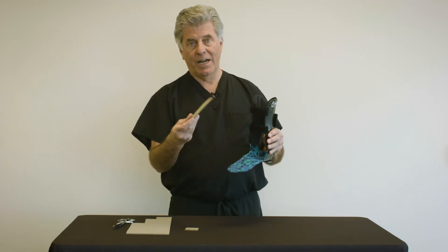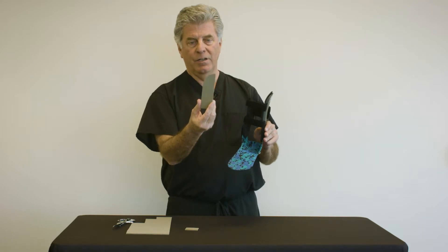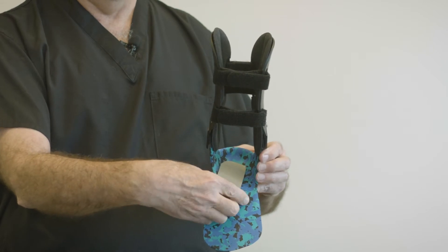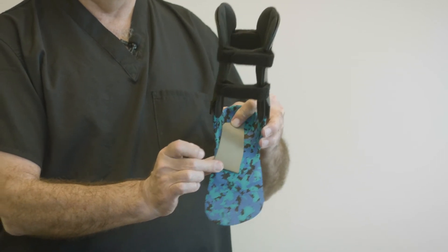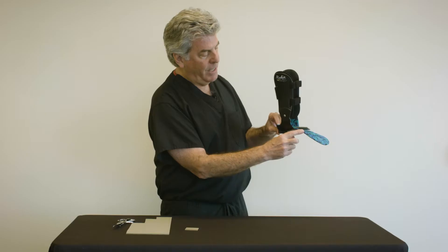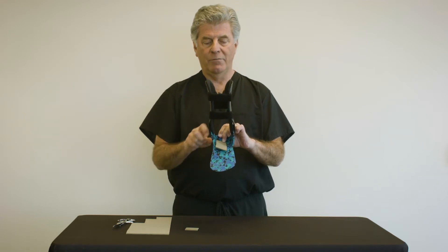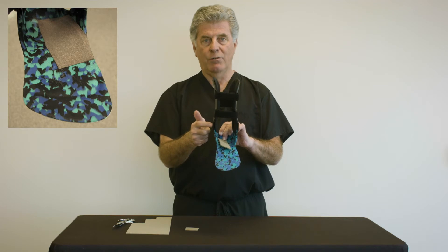The first pad that I recommend would be one-eighth inch corex or felt, cut into this shape, where it is placed inside the medial aspect of the heel cup of the brace and carried out to about the mid-arch area, or the navicular. What this does is create a varus wedge effect to improve alignment. Oftentimes this simple pad will straighten the patient's foot and the rubbing will go away.